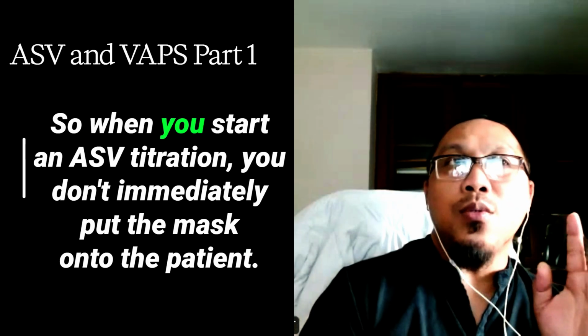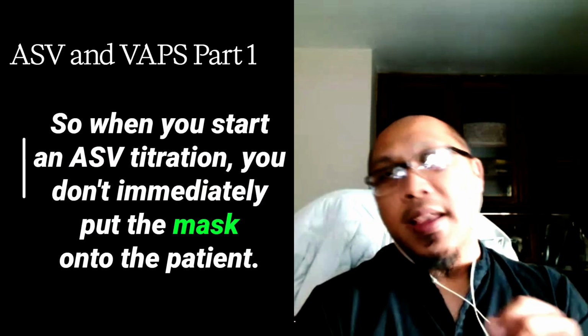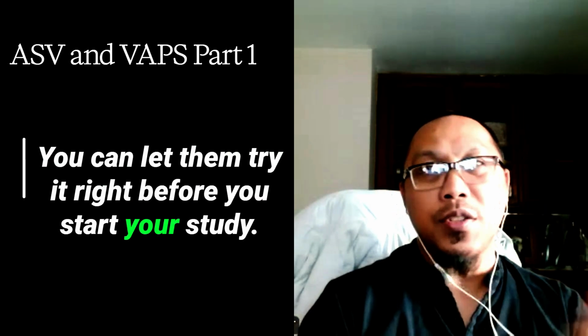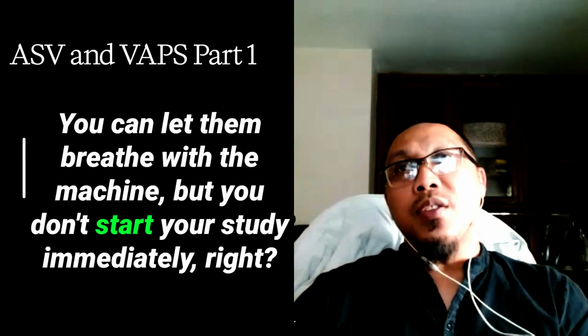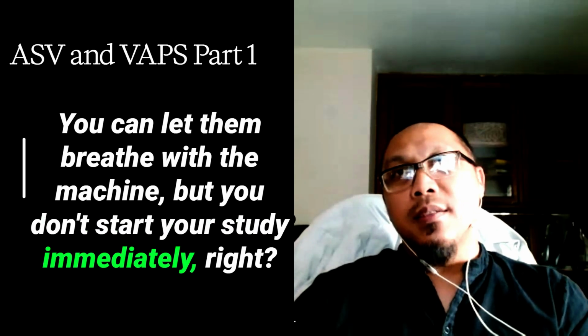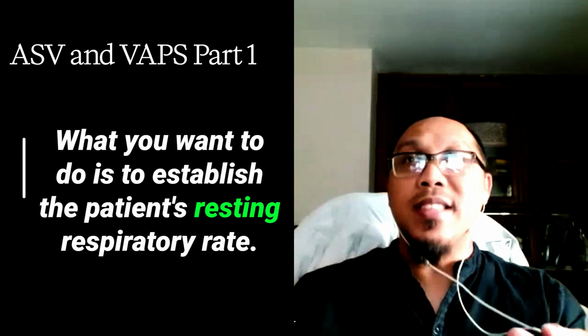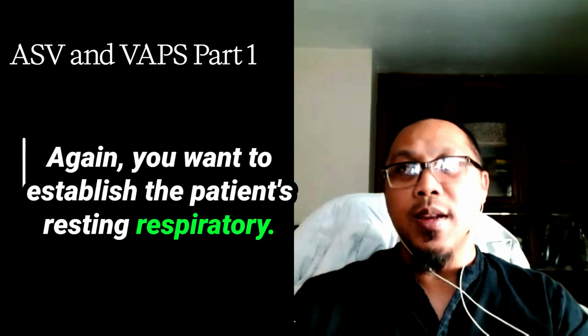So when you start an ASV titration, you don't immediately put the mask onto the patient. You can let them try it, right? Before you start your study, you can let them breathe with the machine, but you don't start your study immediately. What you want to do is to establish the patient's resting respiratory rate. Again, you want to establish the patient's resting respiratory rate.